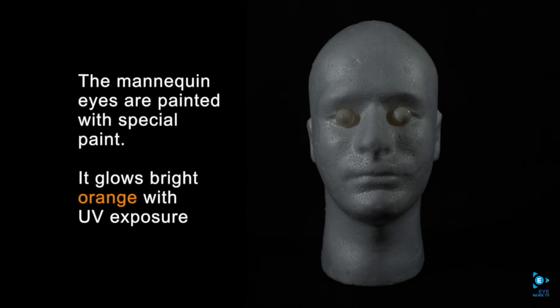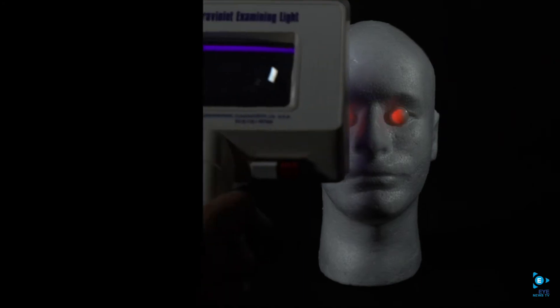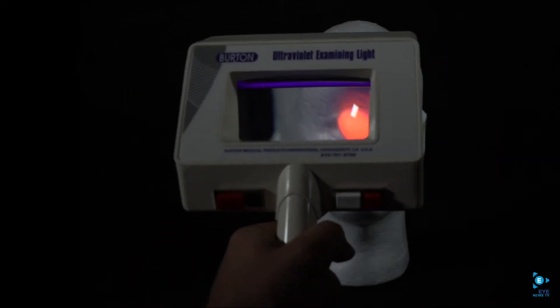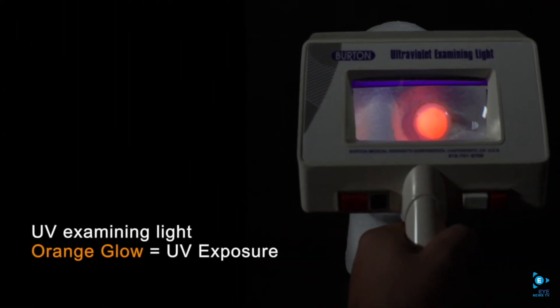This mannequin has eyes that are painted with a special paint that glows bright orange in the presence of UV. Now we're introducing the ultraviolet examining light and you can see the bright orange glow.